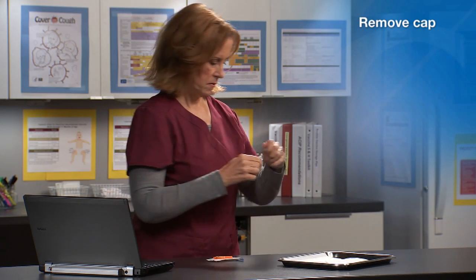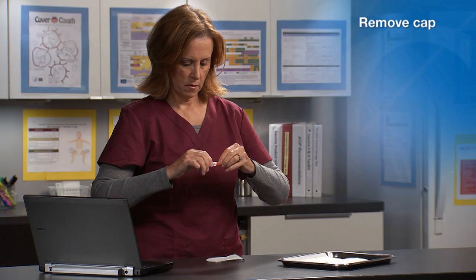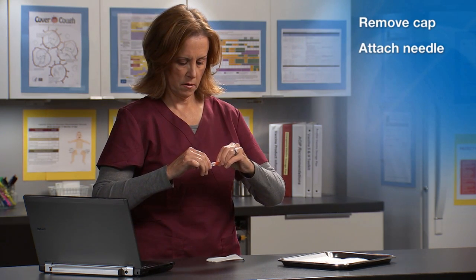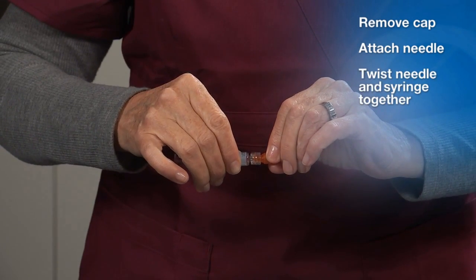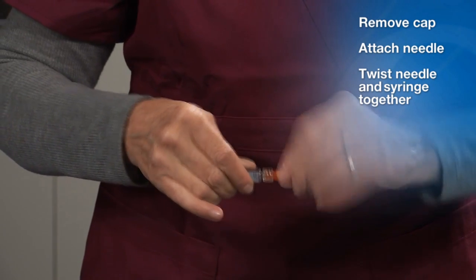Carefully remove the cap from the tip of the syringe. Hold the needle by its protective cap and attach the needle by twisting it onto the tip of the syringe. Twist the needle and syringe together until you can no longer turn the needle or you hear a click.